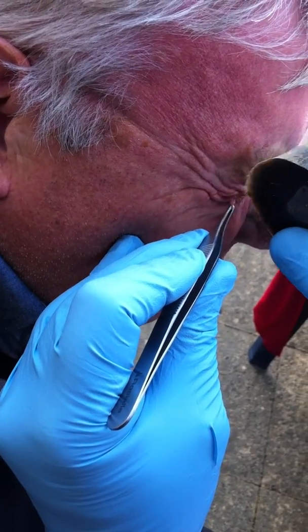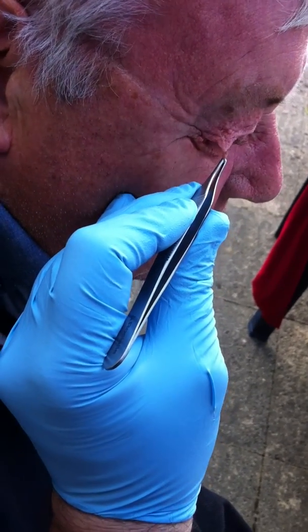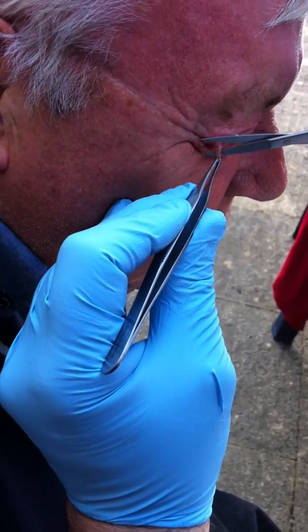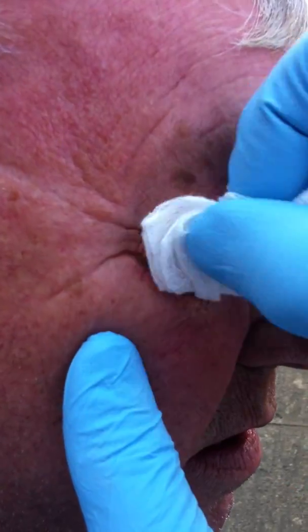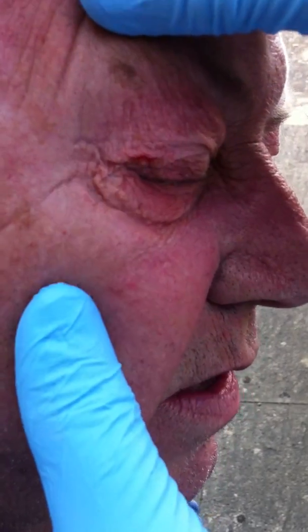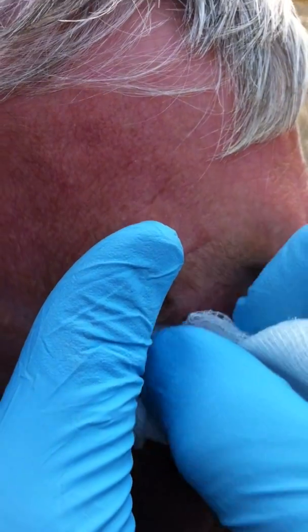Ouch. Very sore. Okay, right. We're going to move over to the modern method. There we go. Would you like a picture of that? Are you bleeding much? It's not bleeding at all. I don't think I'm bleeding from that, am I? I thought it might be. There we are. You see? That will actually heal up extremely well. It will, yes. And won't leave a scar at all. So that is a failed Stone Age operation saved by a modern pair of iris scissors.